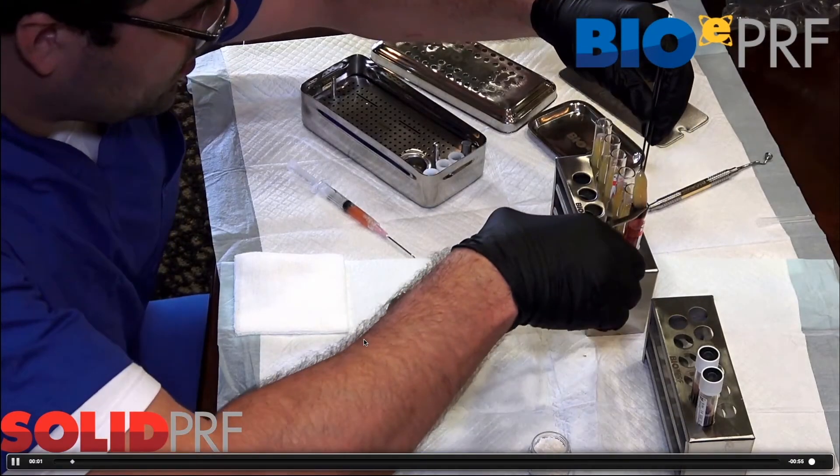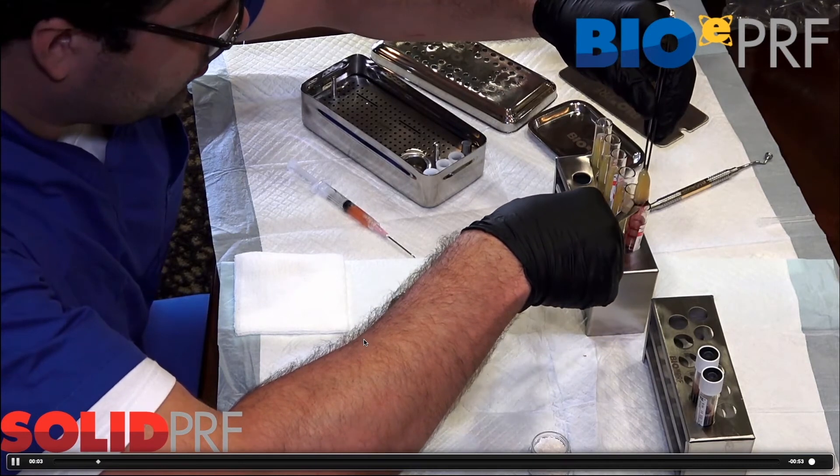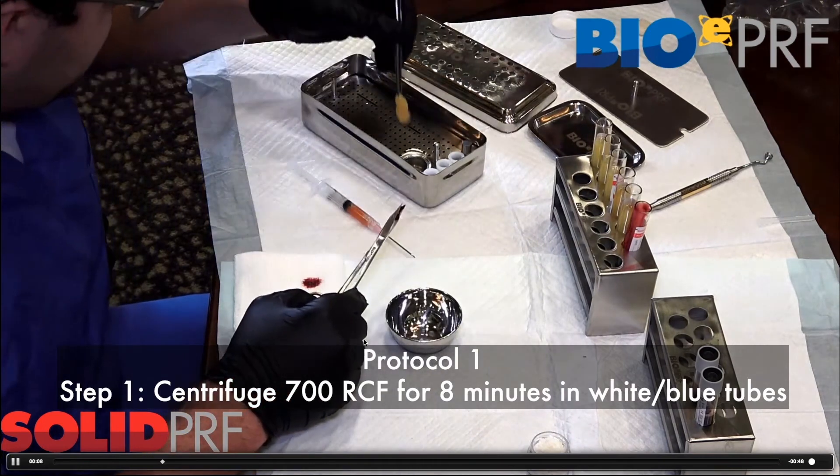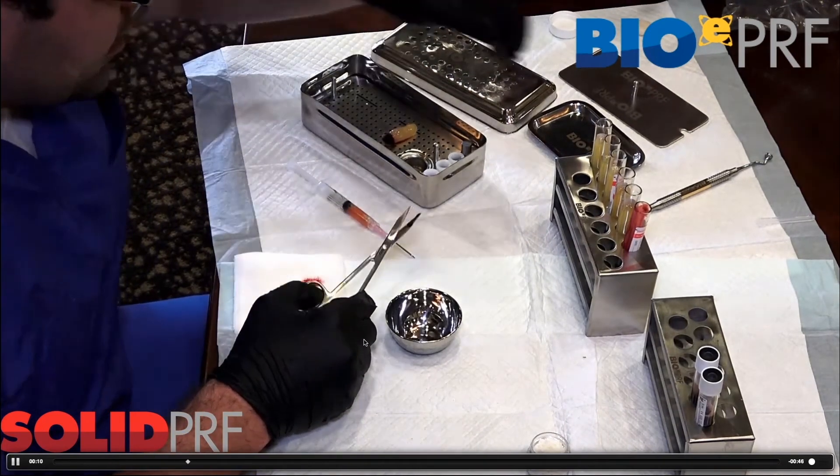This is obviously the easiest protocol. You spin, after the spin cycle pop the lids, and wait five minutes.